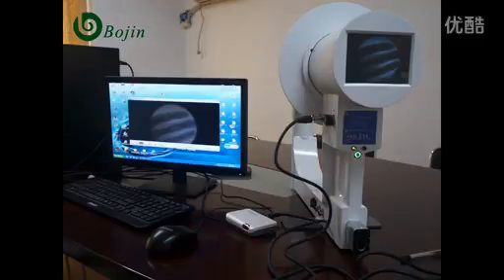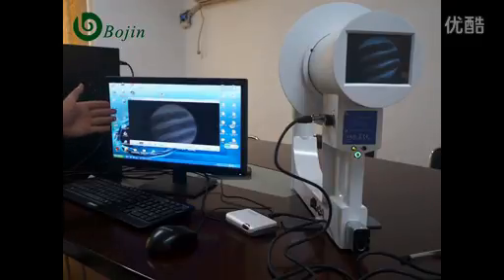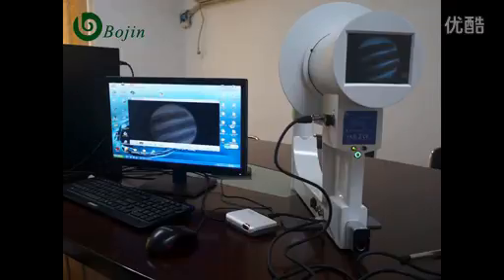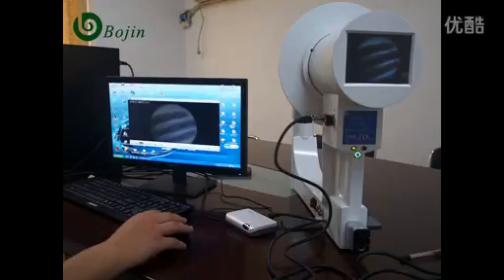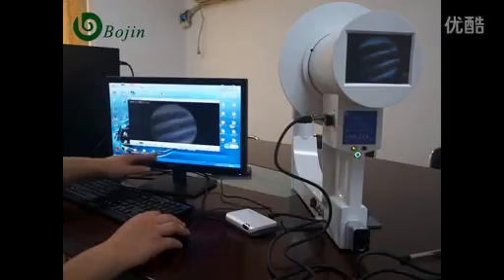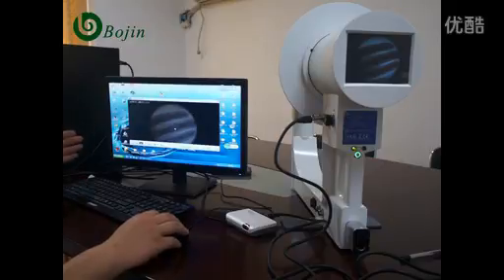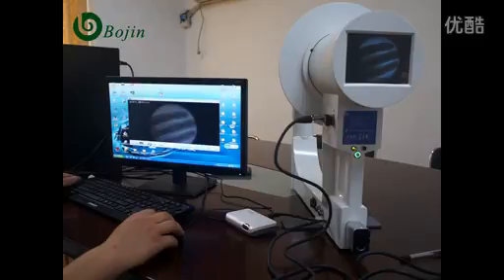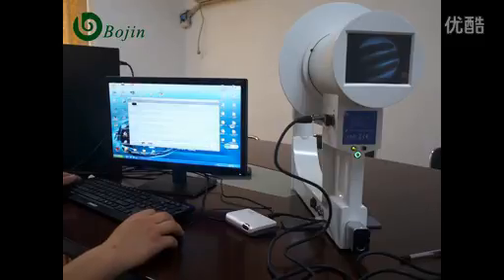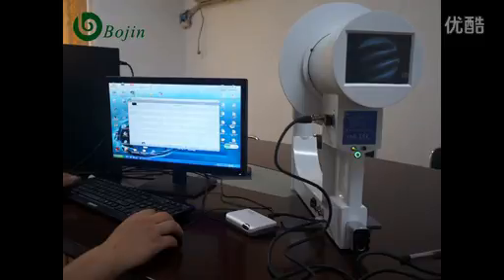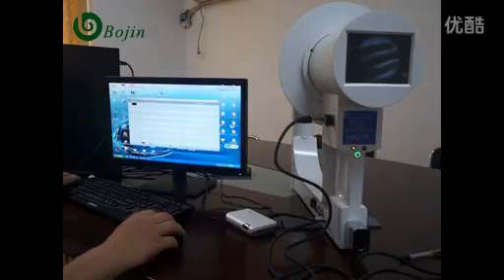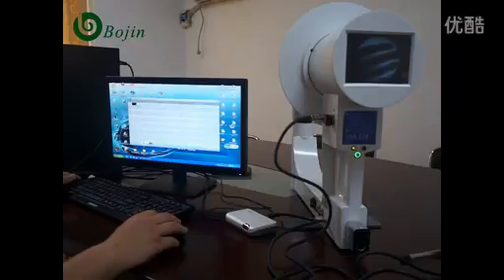Meanwhile, the image is on the PC, on the screen. Please click snap pictures. After the still image disappears, this image will be saved. Click playback — it's on the video. Please click picture. Now you will have got your radiation image.